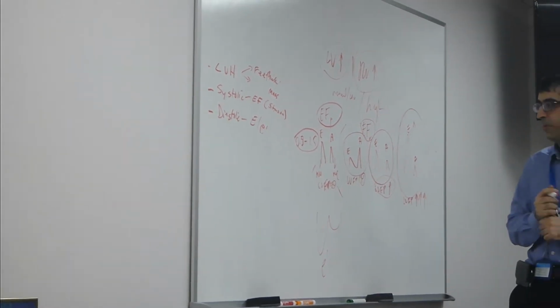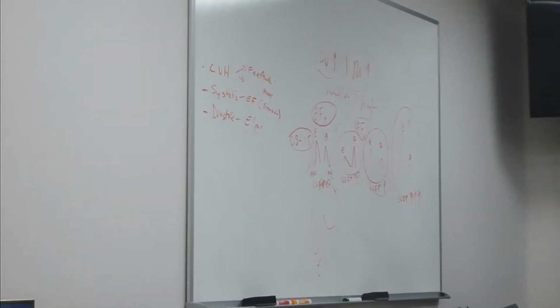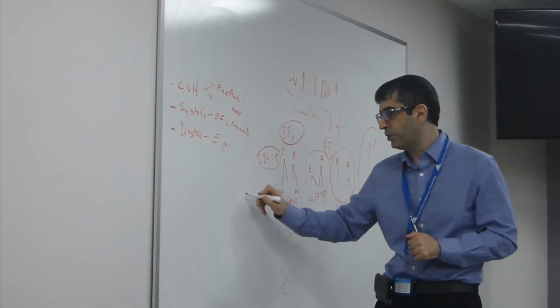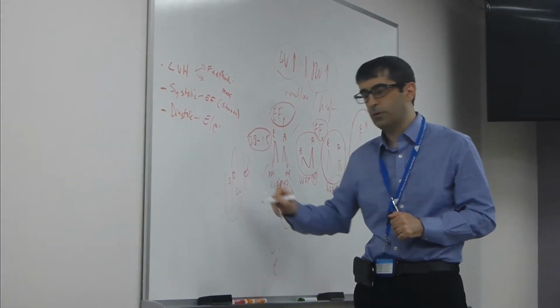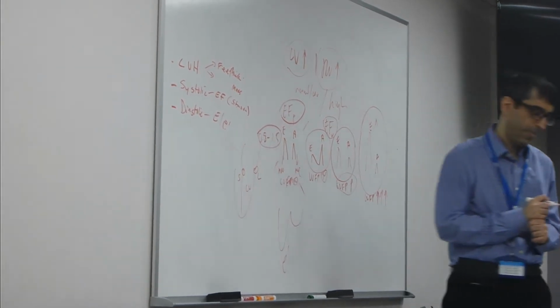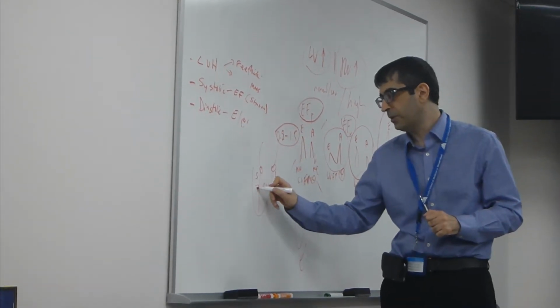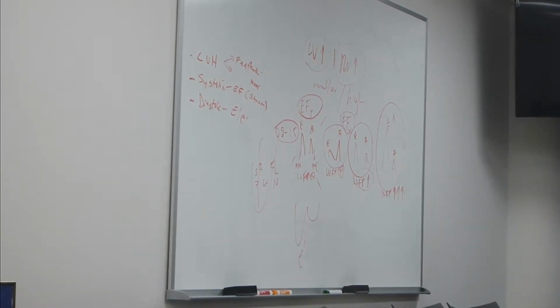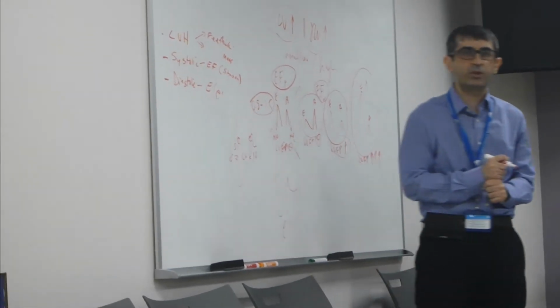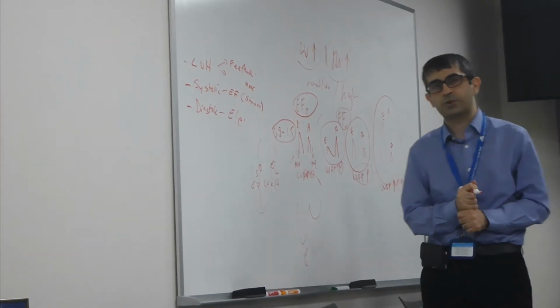So we usually sample the tissue Doppler at the mitral annulus, at the septal level and at the lateral level. If you imagine this is the left ventricle, you sample here and here, so there will be the septal E prime and the lateral E prime. The new guidelines suggested cutoffs of 7 centimeters per second and 10 centimeters per second. The lateral velocity is usually higher than the septal, even in normal people. Based on different studies, if you're less than 7 and less than 10, there's some degree of impaired relaxation, some degree of diastolic dysfunction.